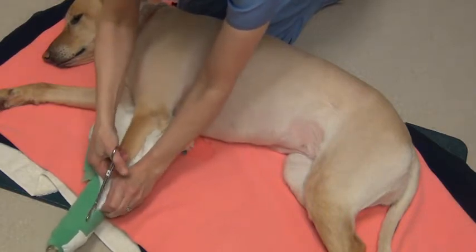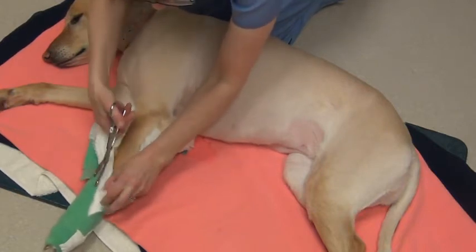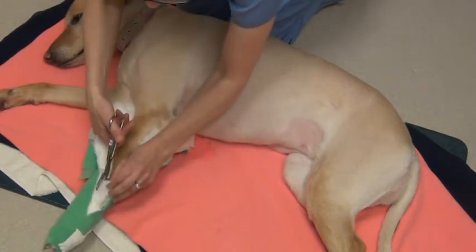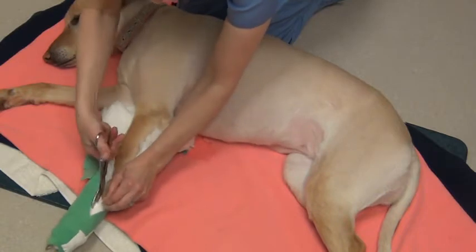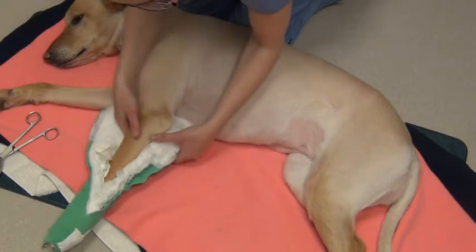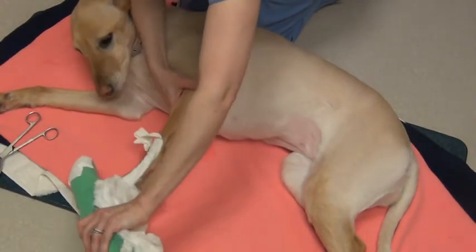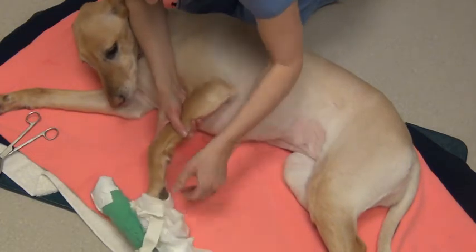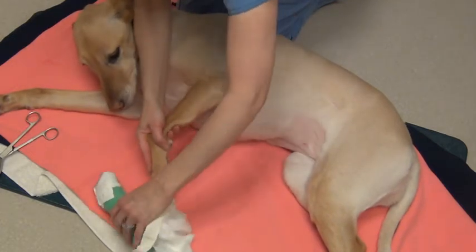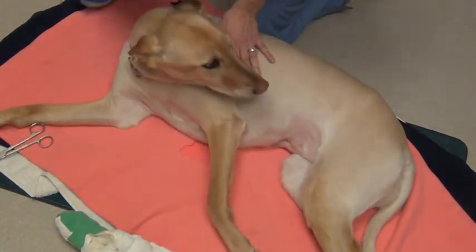Alright, you've got to be careful when you get to their toes. And be careful if you have a splint in the leg that you don't run into the splint. Alright, sweet girl. And at some point you can usually just slip their leg out. But you've got to be careful, especially if an animal has a broken toe or something, not to slip it out too soon. But that concludes removal of the Robert Jones bandage.